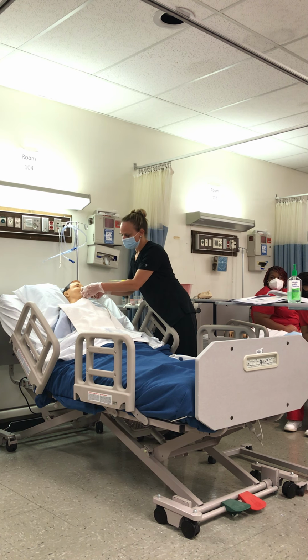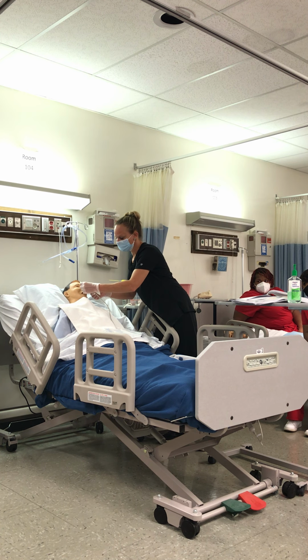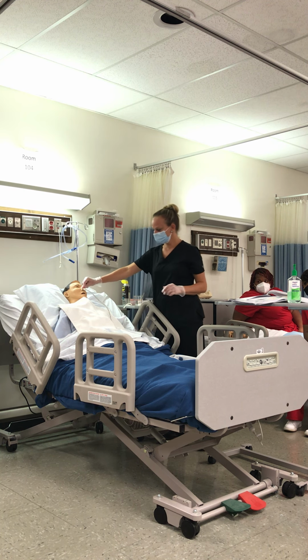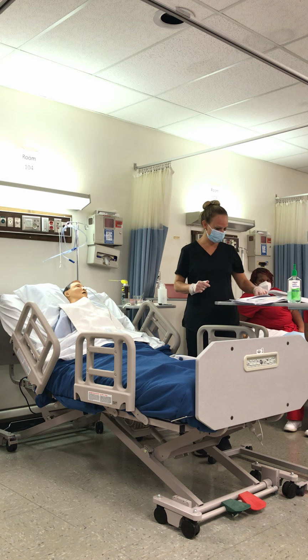You would split your tape, okay? And then what would I do? Wrap it around. You pick one, wrap it around, you pick the other one, wrap it around, okay? So that's there. Do I want to close up the other side? No. They'll appreciate that, if you don't.